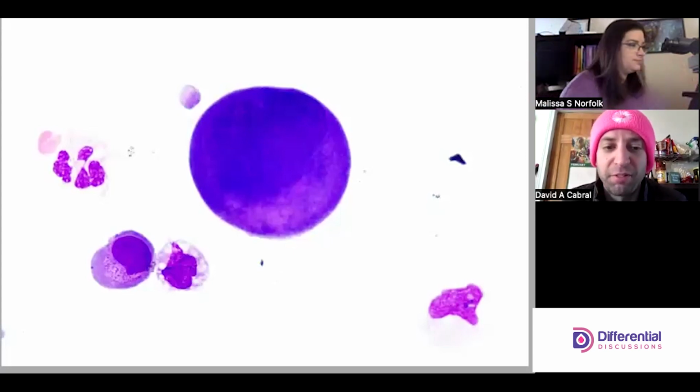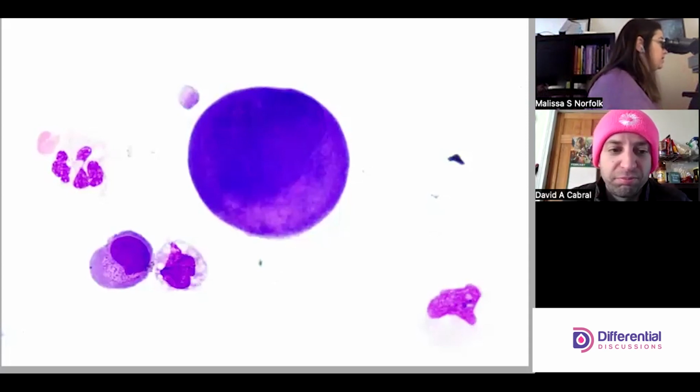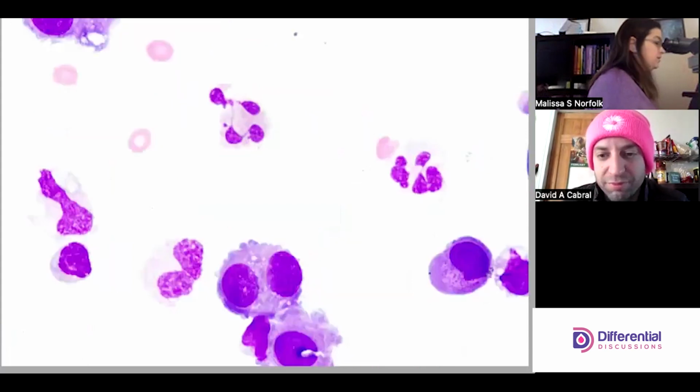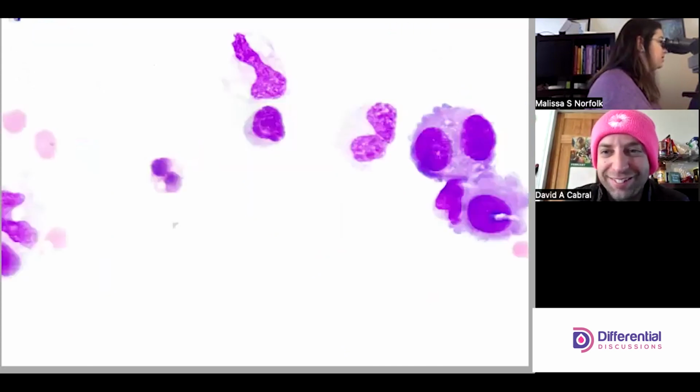Right. So let's look around and see what else we can drag in. There's a nice batch up here that I want to show you, with little blebs, but there's another really nice batch down here.